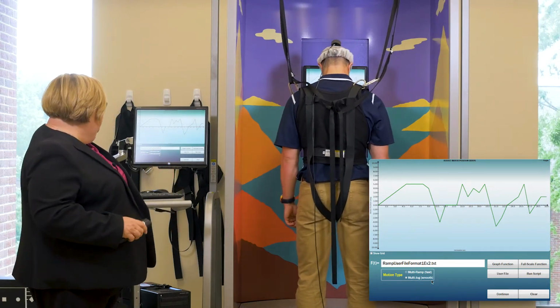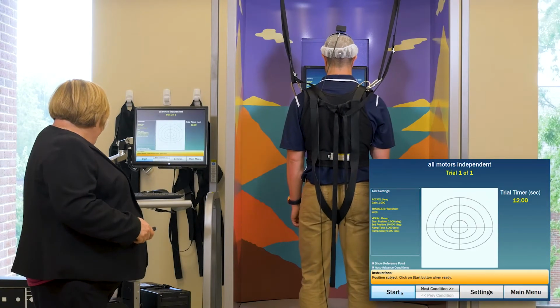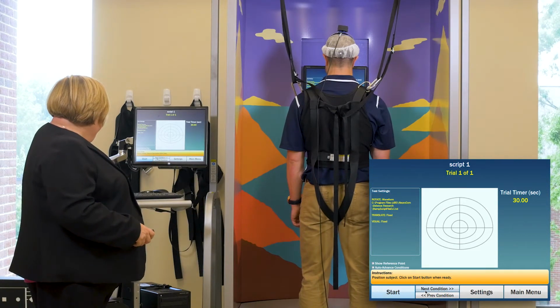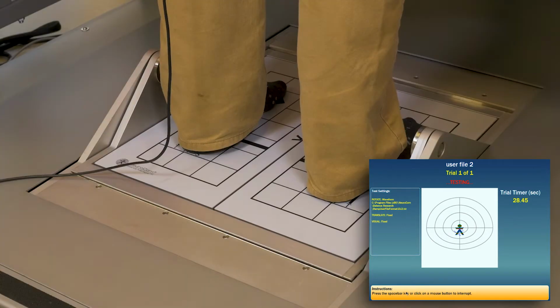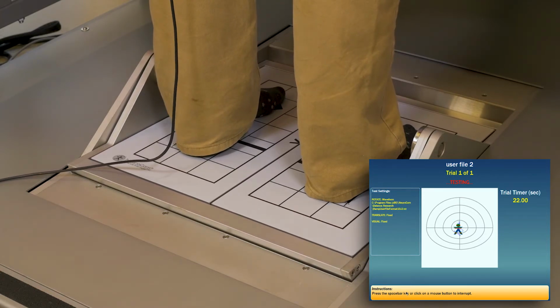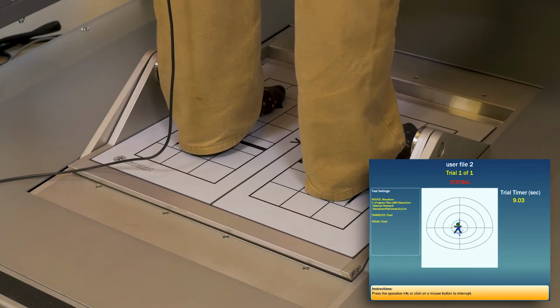So let me show you this one in multi-ramp. And so I have to go to condition 14. All right, so let's do this in multi-ramp. You okay, Trent? Okay, and here we go. And where we're really going to see this is when we look at the motors, all right? But it may be more important to your research to have it really smooth or to have it really fast and accurate to velocities. And so they've actually given a really nice capability with this.